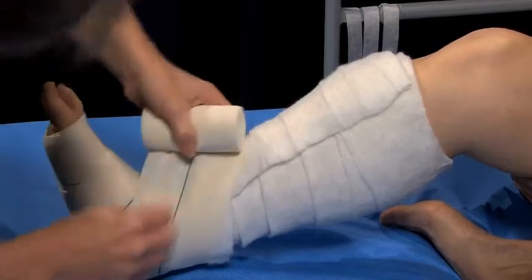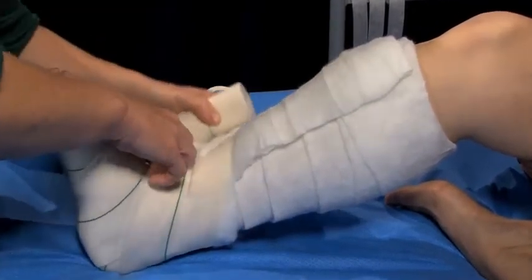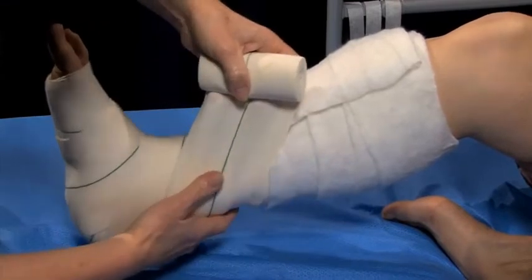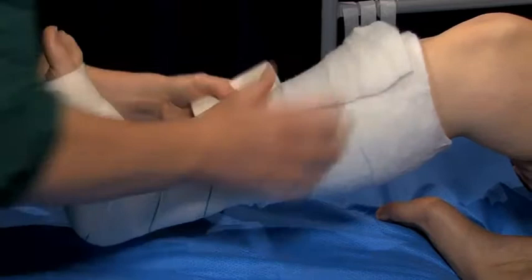Ensure that the recommended bandage tension is commenced at the ankle and not the foot, unless stipulated by the manufacturer. Continue bandaging with spiral turns up the limb. Apply the bandage with 50% stretch and 50% overlap of each layer.